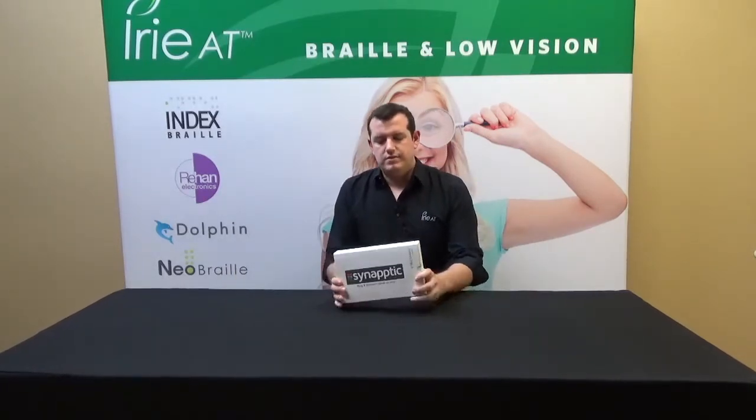Welcome everybody to another episode of John's Demo Room. I'm John with IVAT and today we're going to be taking a look at a device from Synaptic — the Synaptic Mag and Read tablet. It's essentially an Android tablet, but they've designed a complete overlay over the Android user interface to make it much more user-friendly for somebody with low vision. They've added features like a magnifier and OCR that reads to you, as insinuated by the name.